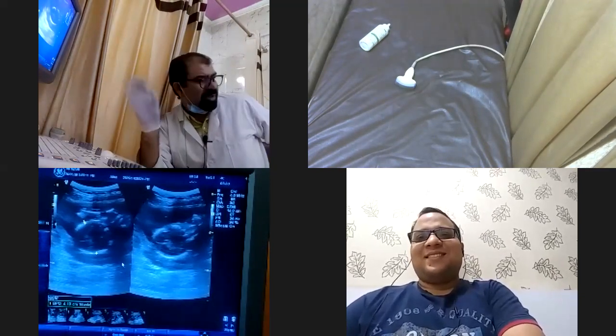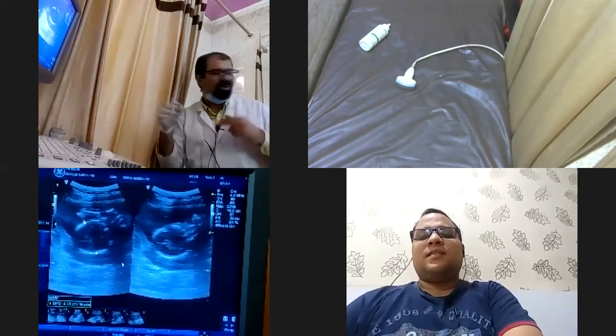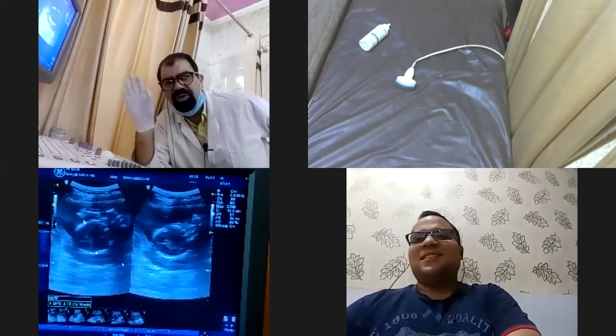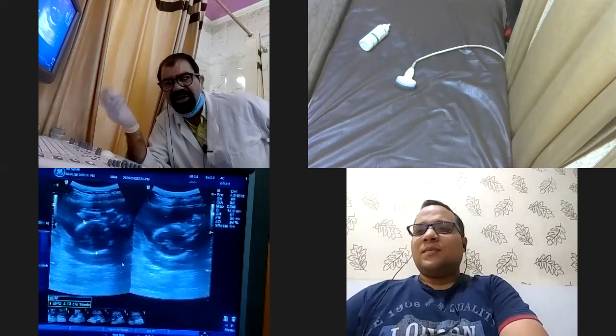So this was a short session. Now I gave you a formula of this button. You can now make out each and everything. We will soon let you know about your next session. So this was just an introduction about the screen orientation and answering your questions if you have any.